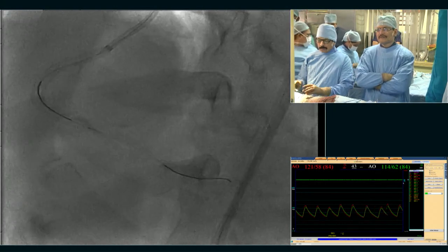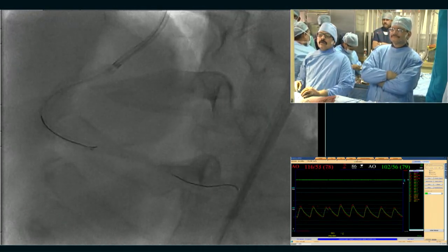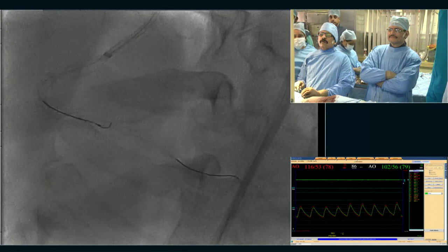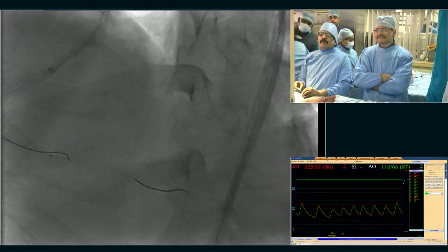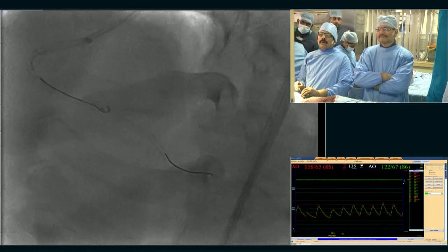And you think of the long-term result as well. And you think the left system is quite good. I hope there was a study before, looking for ischemia. So we are doing all this for a good reason. Yes, perfect. I absolutely agree with your comment.